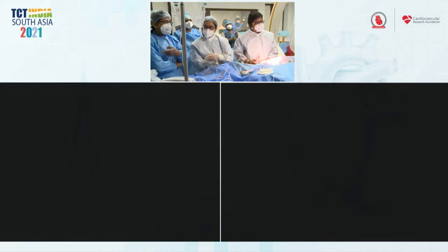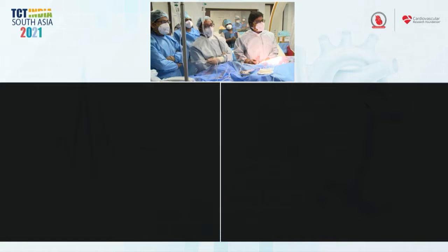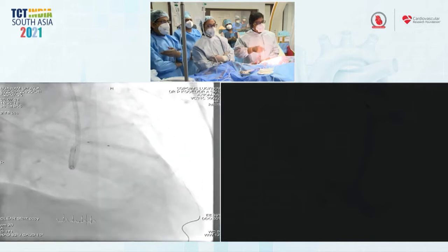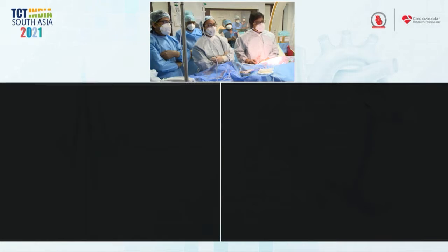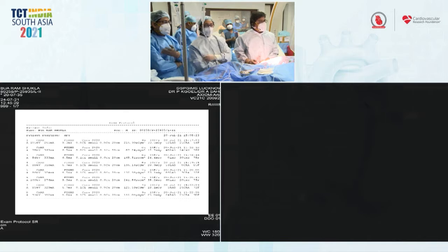And we can just see the last shot, maybe just keep running and go to the last shot. So that's the stent coming up. And then there was a chunk of calcium there, actually, if you see, and that needed a high pressure dilatation. You see that? That's the chunk of calcium, and so finally we managed a reasonable result. Can you see the last angio?